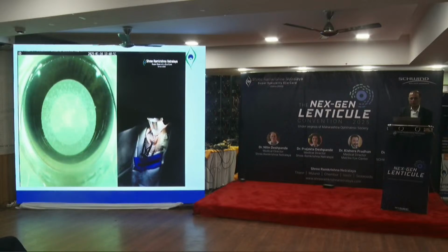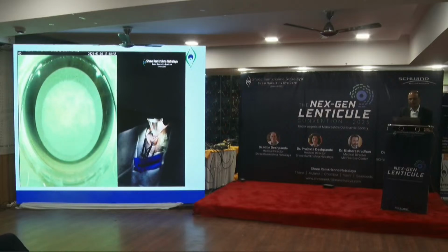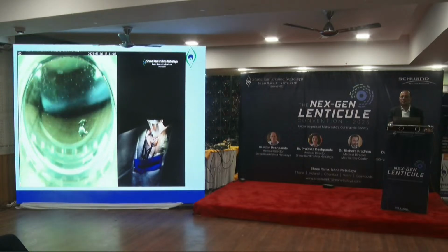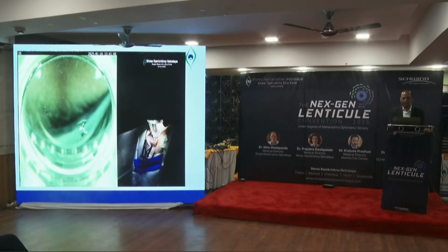You're doing very well, Bharat. This is the cap cut again. Don't move, you're doing very well. So it takes 30 seconds to finish everything, and that's pretty quick. Very good Bharat, don't move at all. It has a very robust recalibrating.